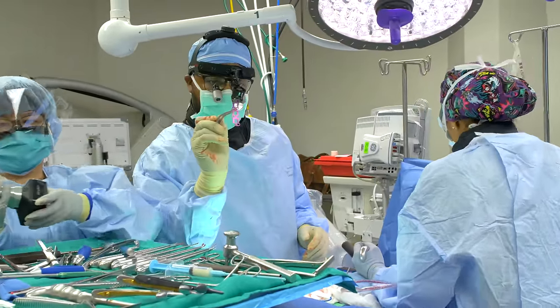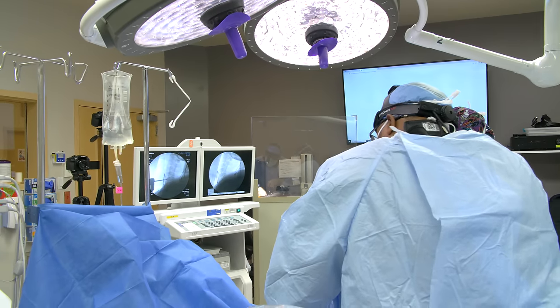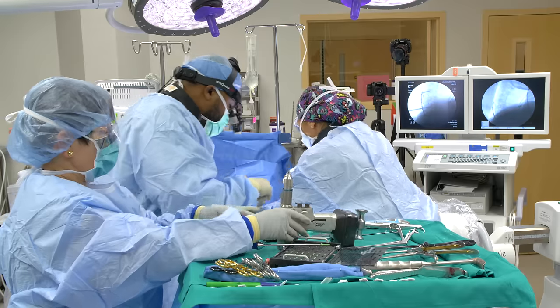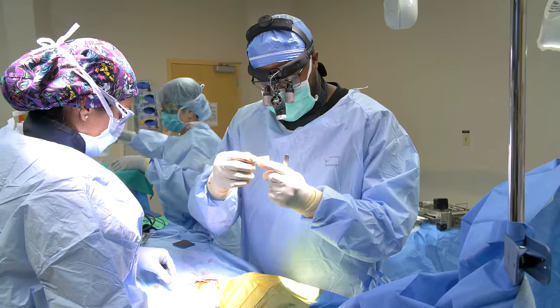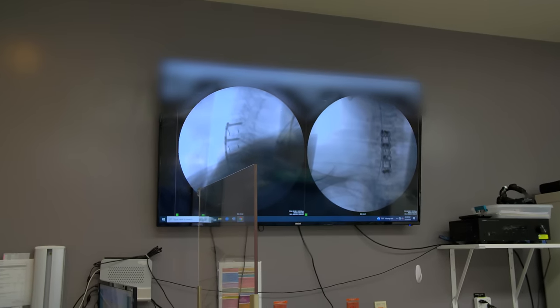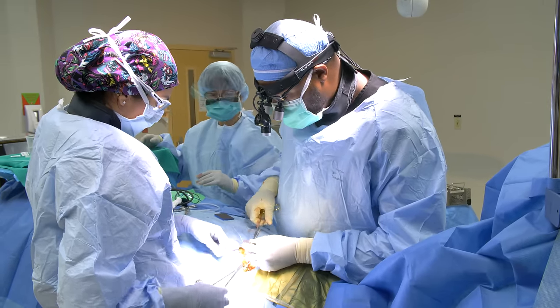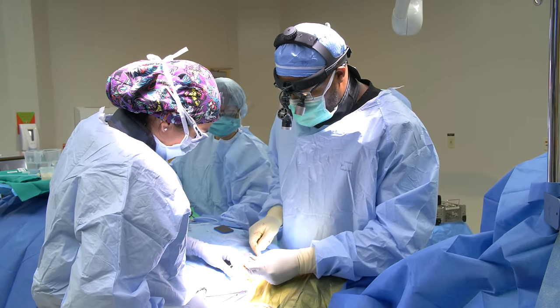This is the plate we're going to put into the spine — just to hold those levels in place and fuse them. This is the length of the incision — about three and a half centimeters, a really small incision. We were able to take the pressure off and decompress those levels. Right now we're just closing, placing some sutures. I left a drainage catheter in his neck to collect any fluid that may accumulate — we'll pull that catheter in the morning before he goes home. He'll stay in the hospital for approximately 12 hours or less.